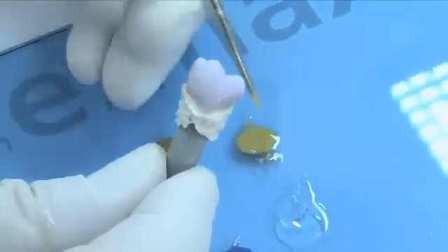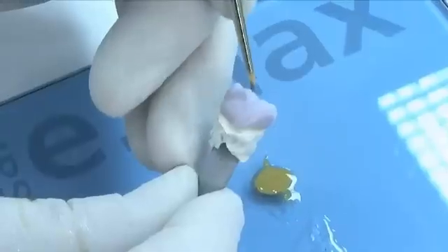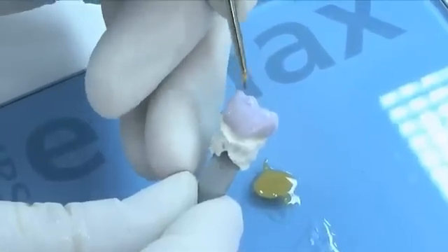To imitate incisal translucency, add a small amount of incisal shade paste to the cusps or incisal region of the restoration.